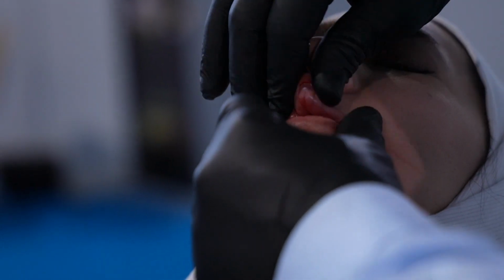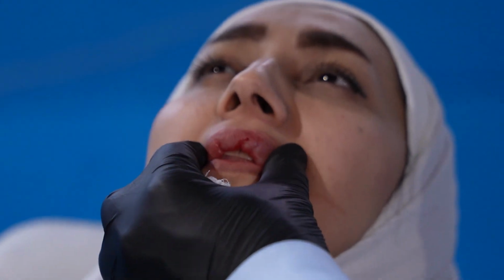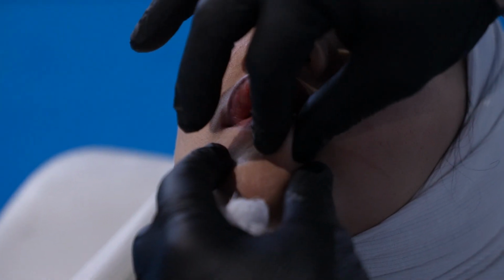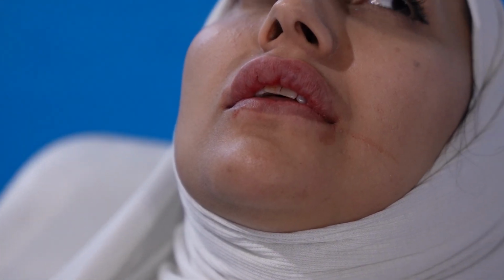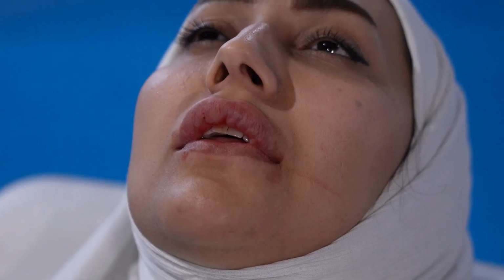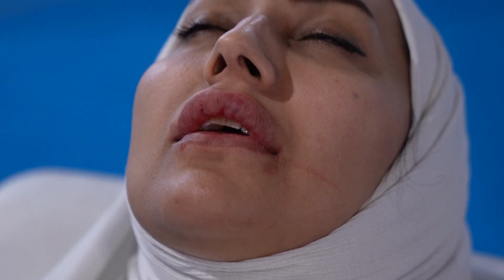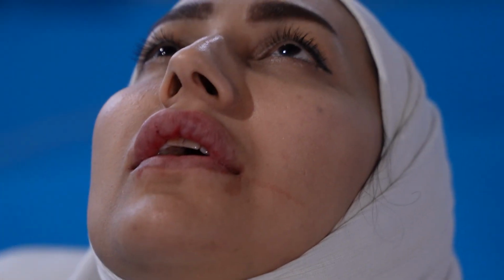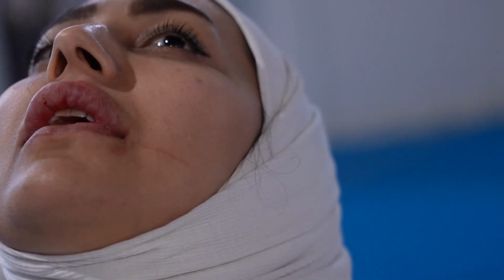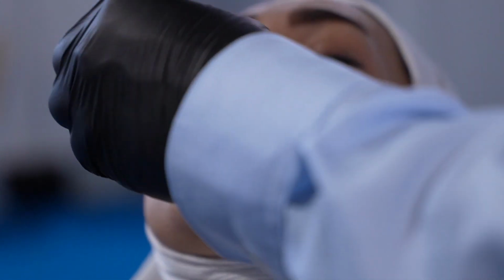The modulation of the filler is very important. I don't call it massage, because massage implies too much force. Just modulation of what you put there is enough. Now we have this lip that would be natural. However, I put too much in the upper lip because she had something like a hare lip, a cleft lip, defects in the upper lip. So I put more than what is needed actually.